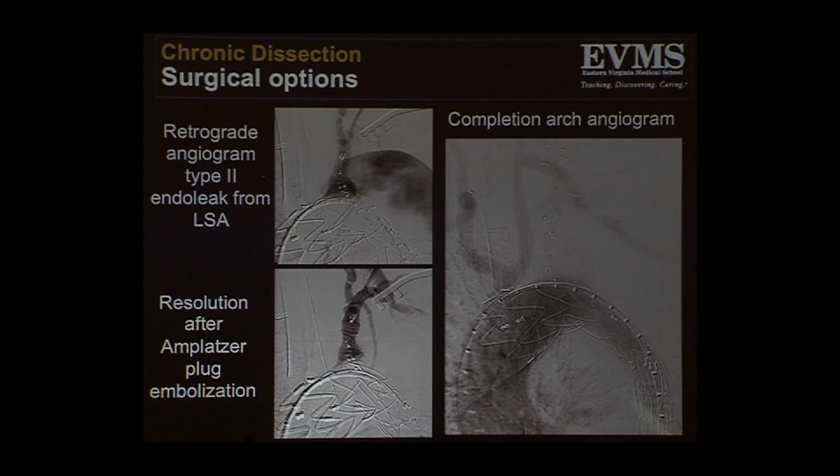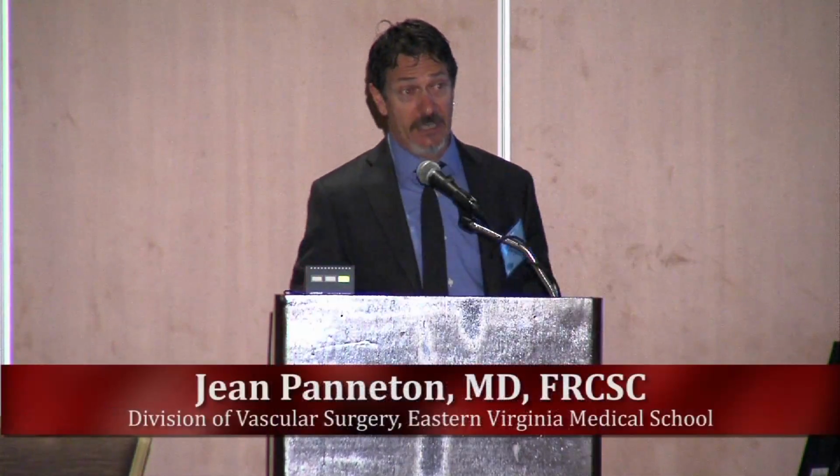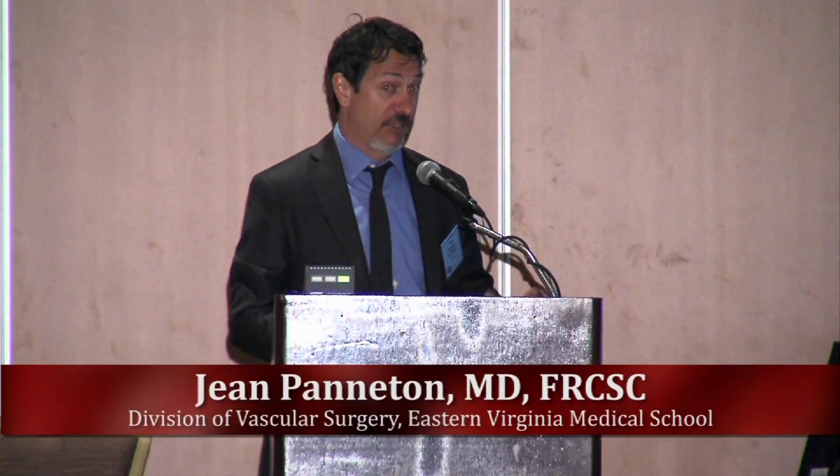All the flow is directed into the thoracic endograft. You see one of the transpositions here. The other transposition is here. This patient happened to be, which is a rare thing, the patient had a common carotid trunk where both carotids come off of a common trunk of the ascending aorta.